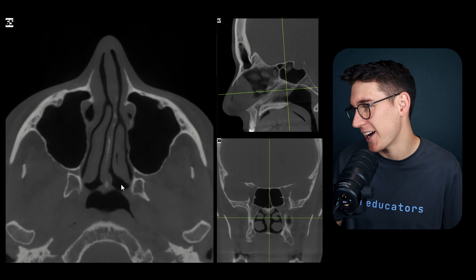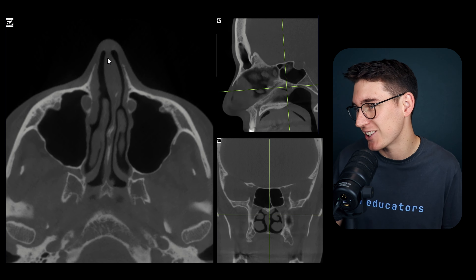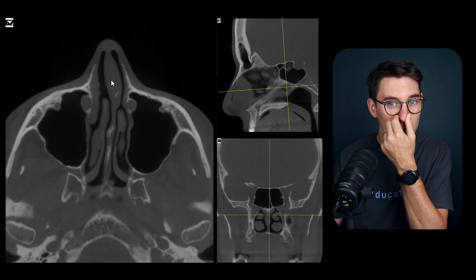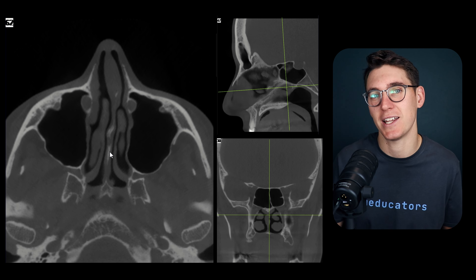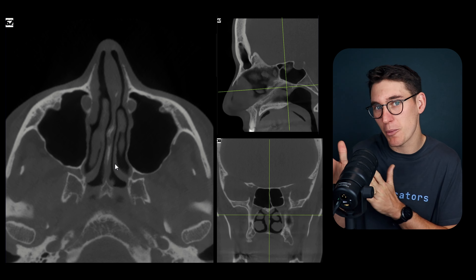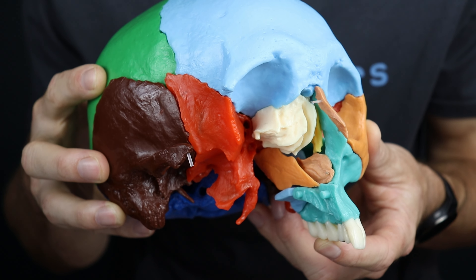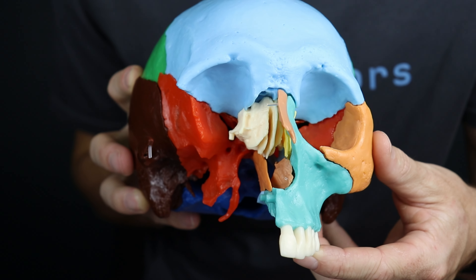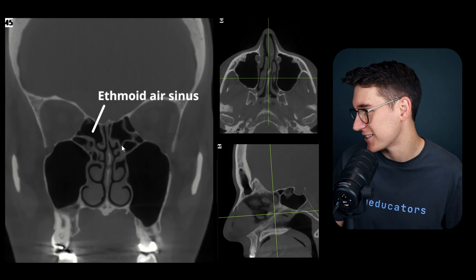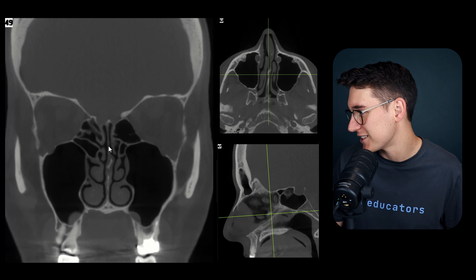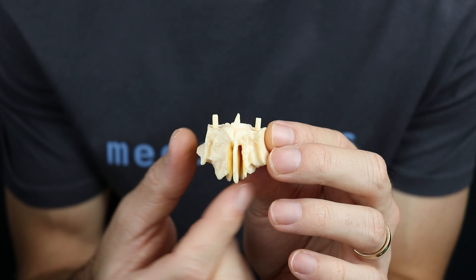The vomer contributes to the bony nasal septum. On the axial slice, some of the nasal septum is bony, and anteriorly there's a cartilaginous nasal septum allowing the external nose to move without bones breaking. Posteriorly it's the bony nasal septum. The vomer makes up the majority of the posterior and inferior part of the bony nasal septum. Superiorly, we have the perpendicular plate of the ethmoid bone. Heading anteriorly on our coronal scan we see the ethmoid air sinuses with a perpendicular bone running down the middle - the perpendicular plate.